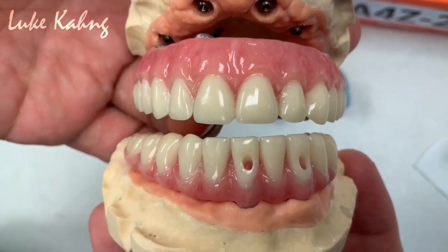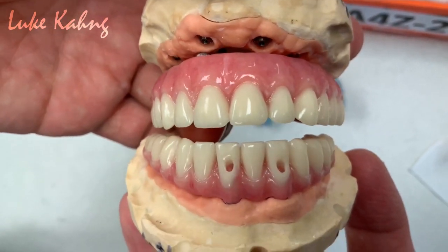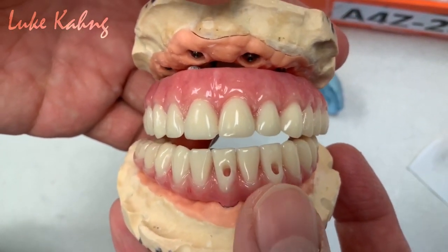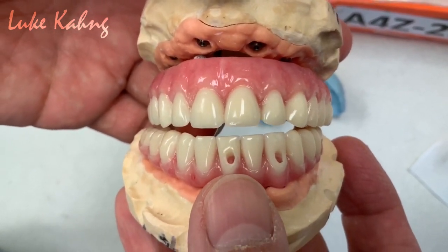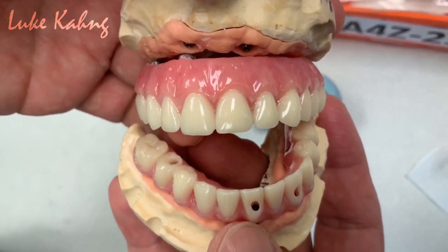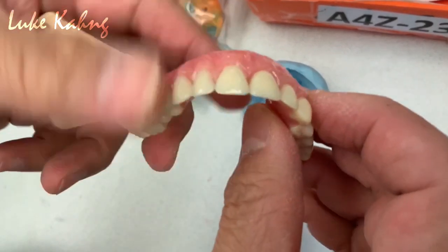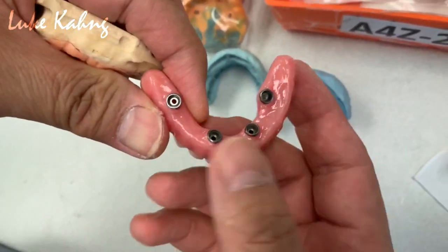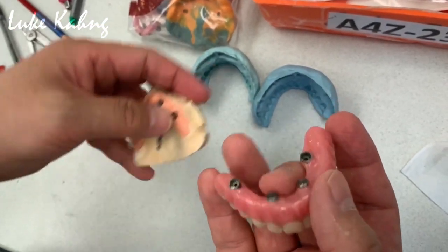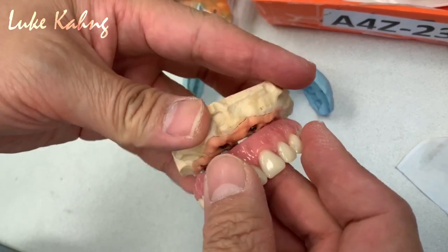Guys, this final is beautiful. Cyton 3000, which is hybrid acrylic, 8 implant case. This one the doctor can put the composite after they screw in. Then we make it really slim and change a couple of times, we're trying to make it flat and could modify it even though this. So we push it like that.